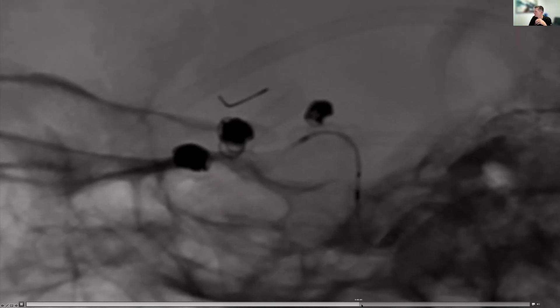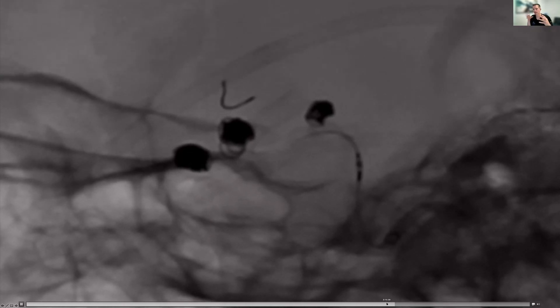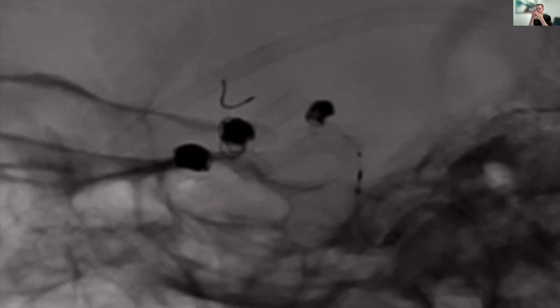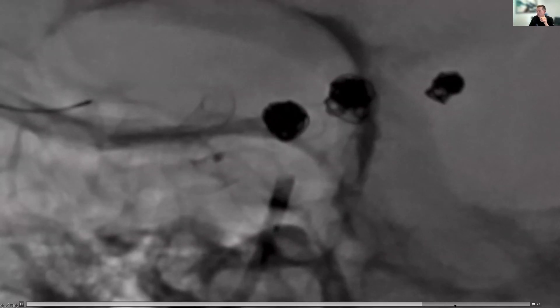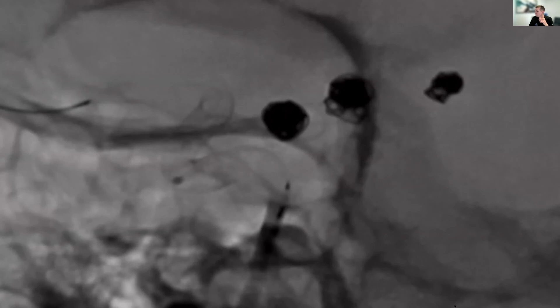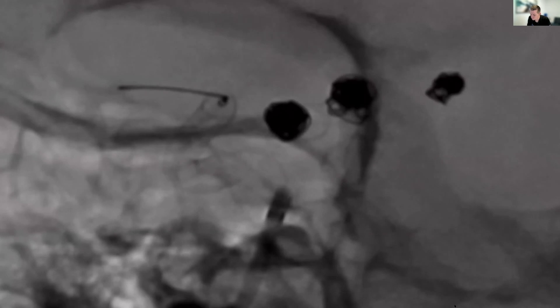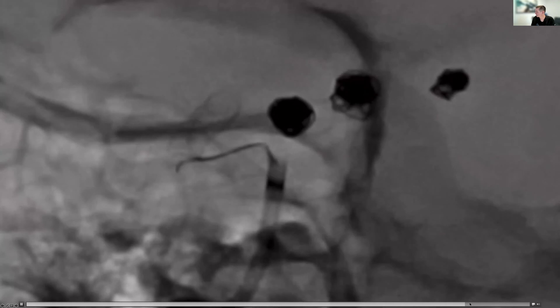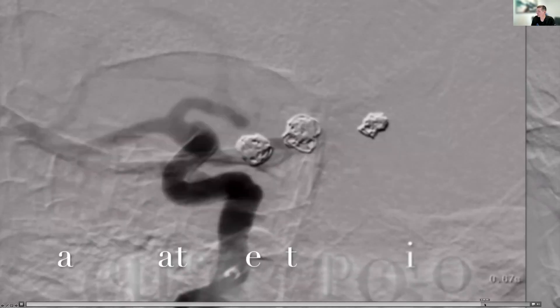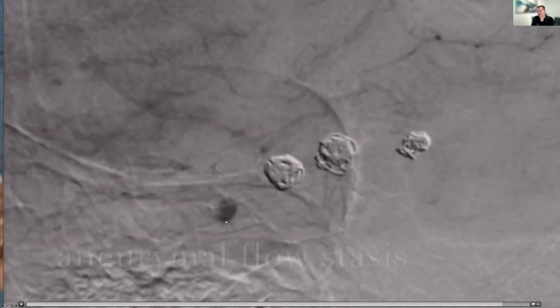We're coming around the corner into the cavernous segment. Once we think we have the stent in a pretty good position, we push on it to load it forward. That's going to compress the cells of that dense mesh and really give us good wall apposition and exclude the aneurysm around that corner. We bank our microcatheter against the walls of the stent, really trying to make sure it stays open and up against the walls. Once we've got that, we retrieve our wire, do an injection, and see that we've got good apposition and — more importantly — flow stasis within the aneurysm, which is a sign this is going to go on to occlude.